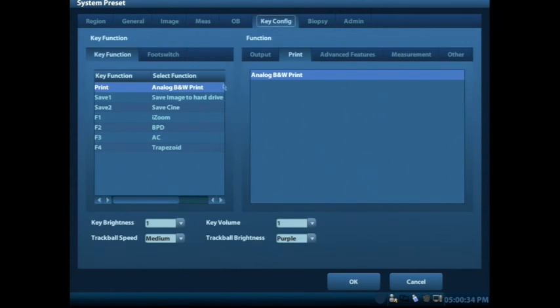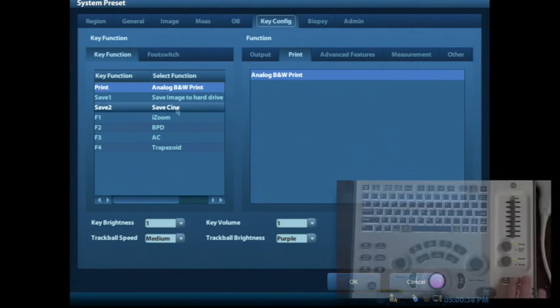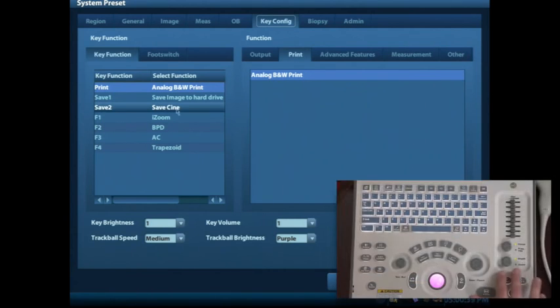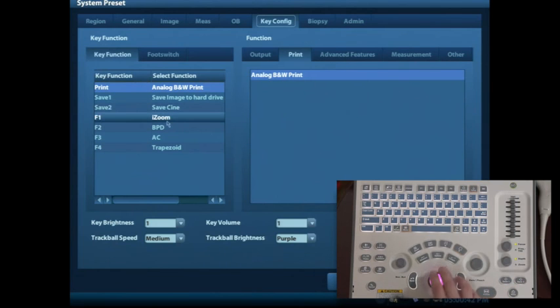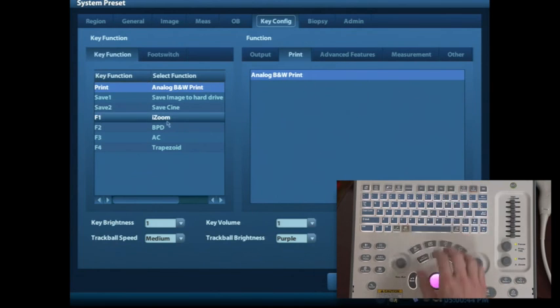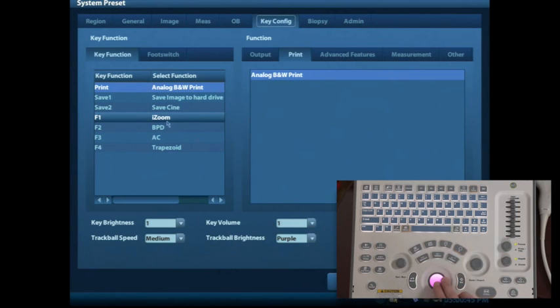One of the things I want to point out to you is under the key config, that's the key configuration, where you see what the print button does, what the save one and save two buttons do, which are down here on the right corner of the machine, as well as the F keys, which are right up on the top of the screen.